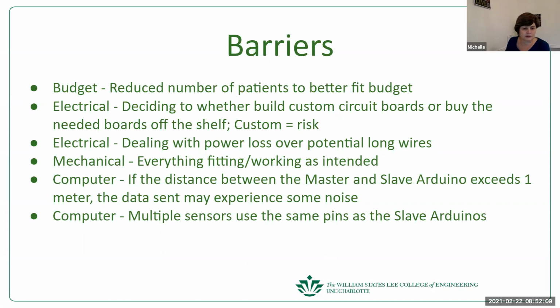How long do you expect these cables to be? Well, since we are having a minimum of 6 feet just between patients, so 2 meters at least. Yeah, 2 meters. The reason why I say we may experience some noise is we might get it from other devices, not just within the system.